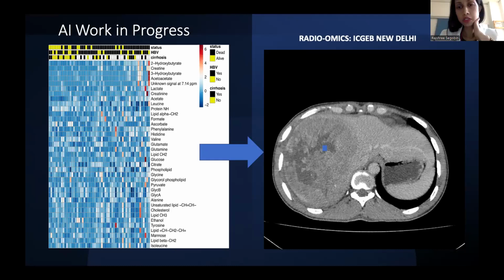Like I showed in the previous slide, you would also look at the walls of the vein. An irregular appearance of the walls of the vein would make it look more like tumor thrombus, tumor in vein, versus the classical intravein thrombosis from other causes.